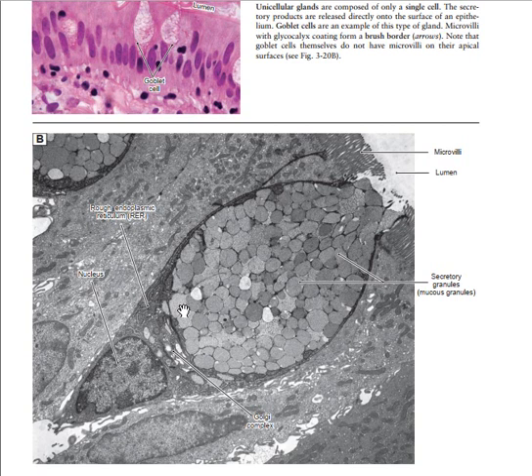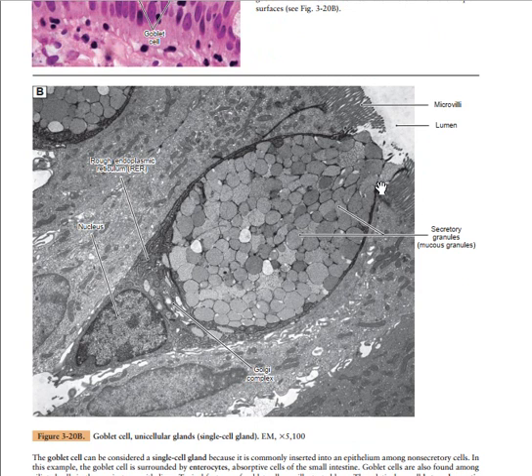But in the case where you have multiple mucous cells together to produce a gland, you now have a multicellular mucous gland. Is it clear? So that is it. Here these are the microvilli of the enterocyte, because they are also simple columnar epithelium just close to it.